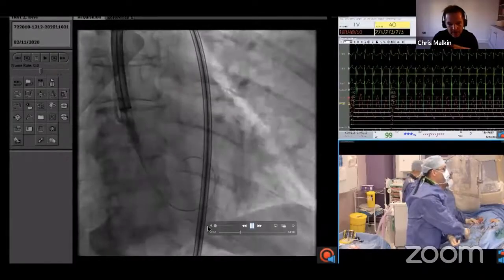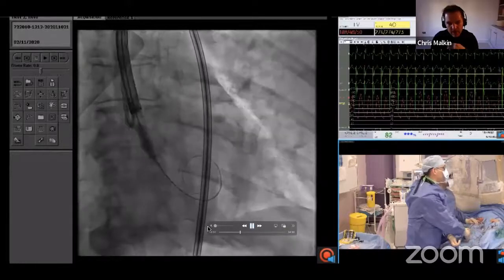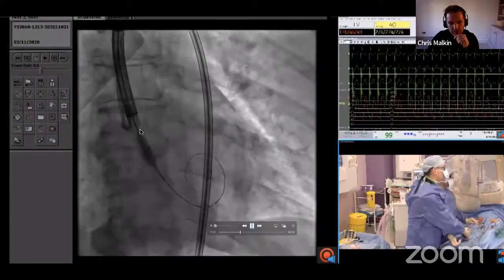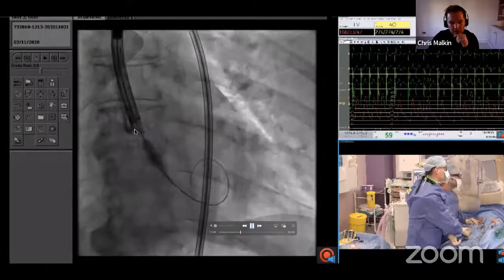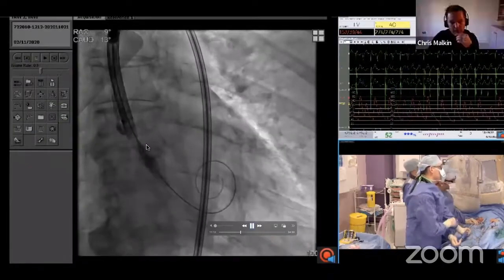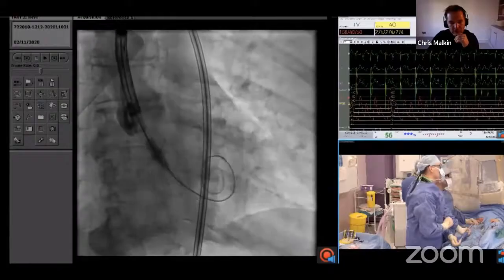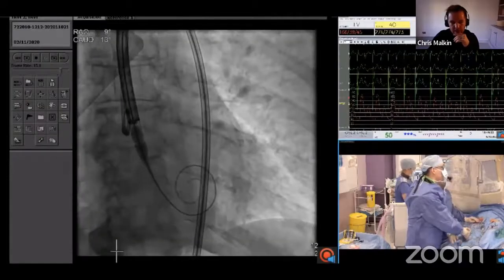Finally, you can see how this implant is different really to how it was even 3 years ago. You start very, very high with the delivery catheter only just below the pigtail, and you allow the valve to slowly come down inside it. And this minimizes the engagement of the equipment in the LVOT. It's thought that that is one of the reasons that this implant technique reduces the risk of conduction disturbance. You can see that the valve is very high now. It's deliberately very high, and I'm allowing it to drift down into the desired position.